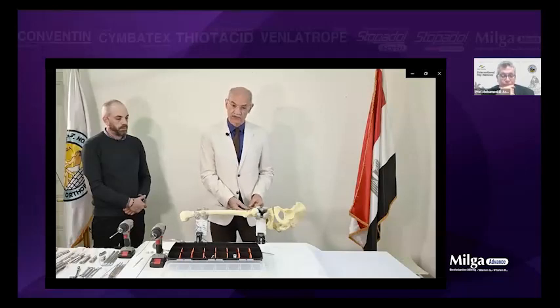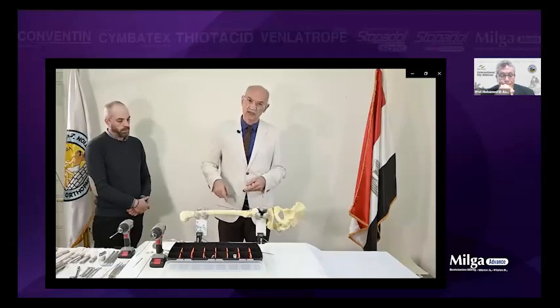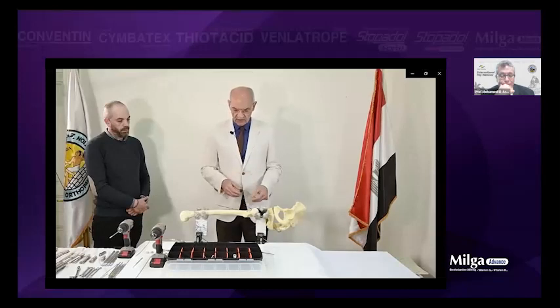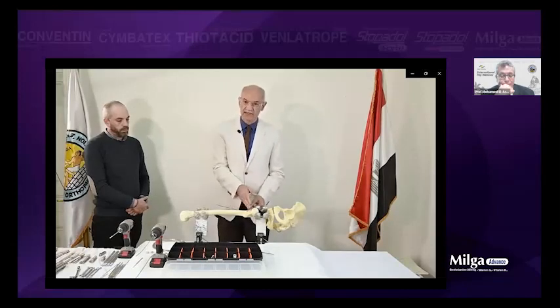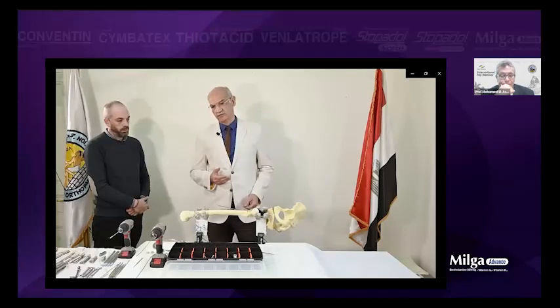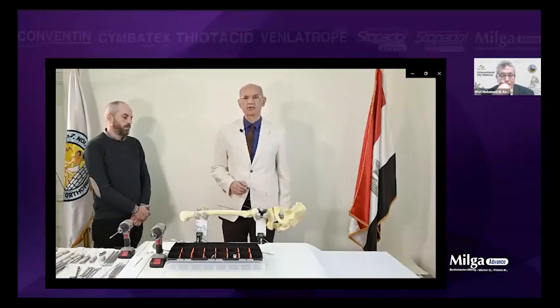Now, this is the fourth. I've told you the 4 methods of fixation: using the serrated wires till you reach the subchondral bone, using half pins in the direction of the neck, using cannulated half pins, using half pins in the direction of DCS, like this one, or any combination. The 5th method, if you have a rare problem of the proximal femur, you can add supraacetabular fixation. And I will show you how to fix the supraacetabular area.